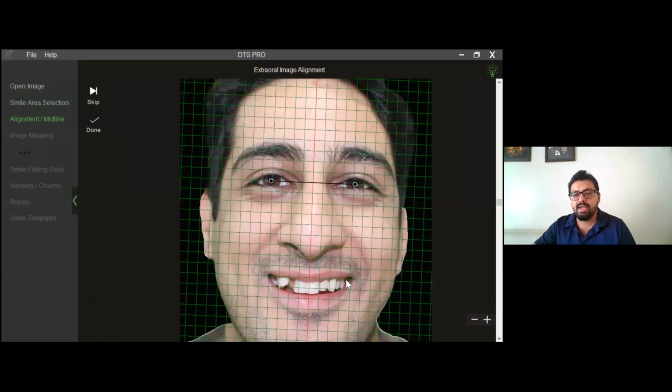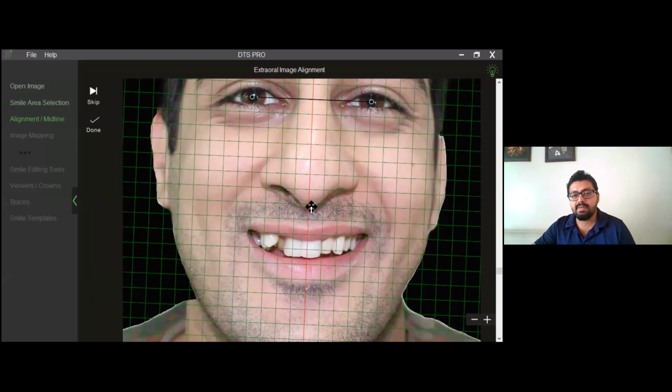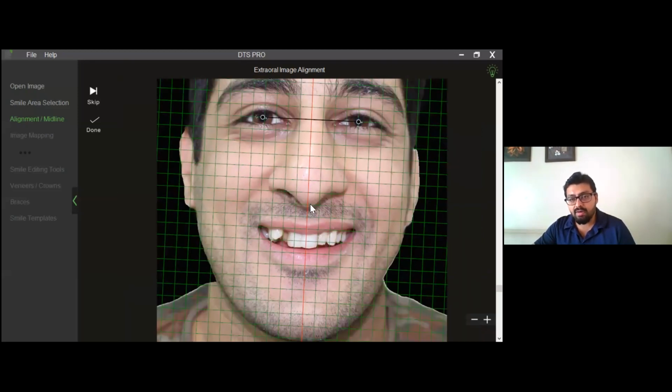These digital tools help us in seeing a lot of parameters which we may not necessarily see 100% in the first visit itself when the patient is sitting in the dental chair. So photographs go a long way in any case to act as a lot of information. They provide us a lot of information with the patient not being in the dental chair.